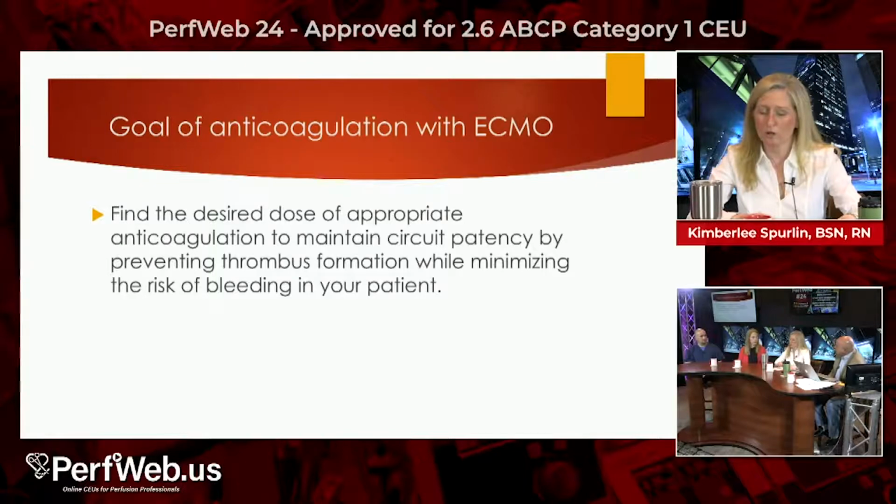That's one of those things where the physicians will give you a protocol, say meet these numbers, and it's more of a balancing act between nursing and perfusion. Absolutely, because you can't just go by the number says 50. That's a great number, there's no clotting going on there, as long as you have good flow. Exactly, but it's like, what's going on with your patient.